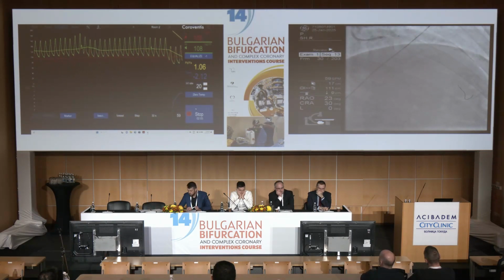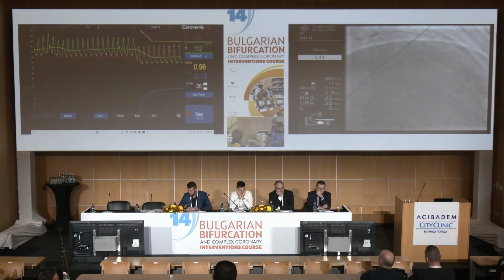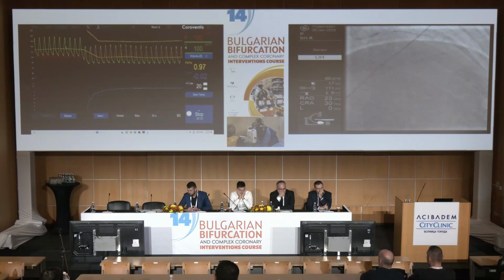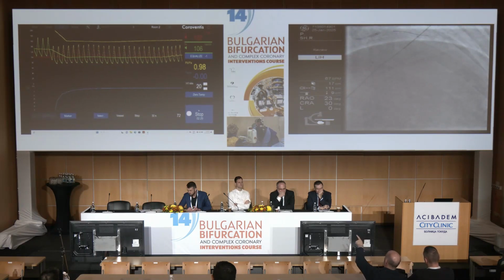You see that the pump stops immediately. Sorry, Valérie, I'm in your way. No. The pump has stopped. There is no infusion anymore. And you see that the temperature goes back to the baseline. Very nice. And when we are back to zero, we are all very, very happy because it means that there has been no pressure drift. And I can stop the recording here.